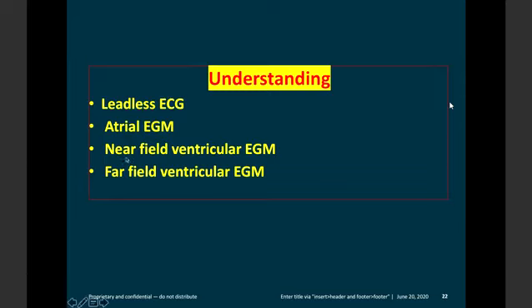Each word is very important. I want to draw your attention to these 2 important things. Near field ventricular electrogram and far field ventricular electrogram are very vital to our device follow-up, as we will see later. I just want to introduce the concept called near field EGM and far field EGM at this particular stage.